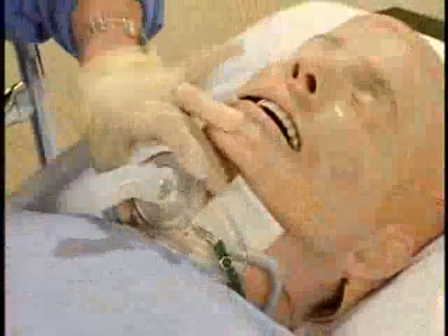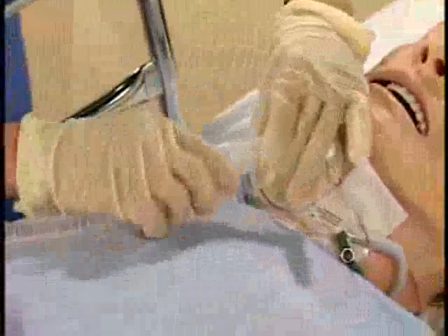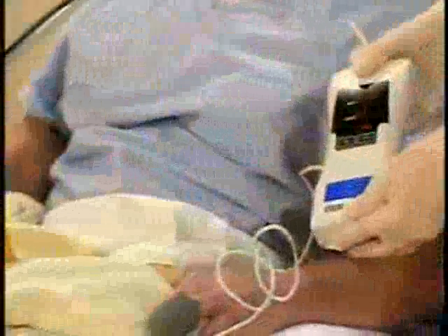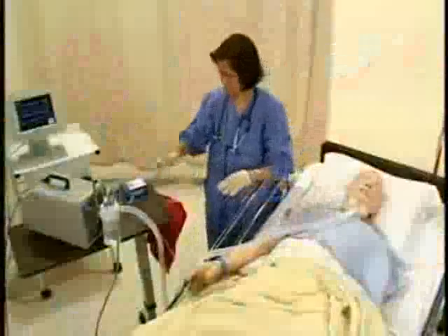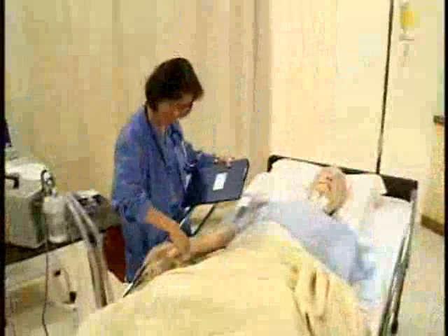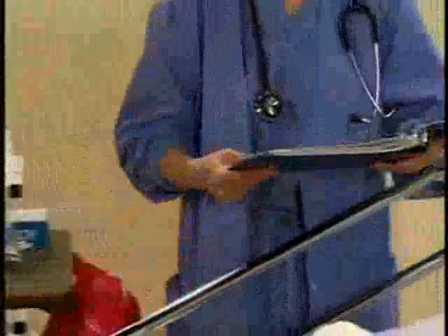For oxygen administration via a tracheostomy or endotracheal tube, you will need a T-tube adapter or tracheostomy mask, oxygen tubing, an optional pulse oximeter, and a humidifier with distilled water and a warmer. Begin by verifying the client's identity and checking the physician's order.